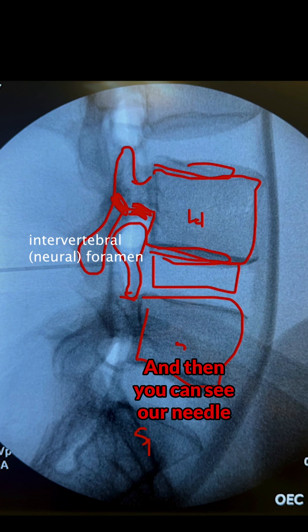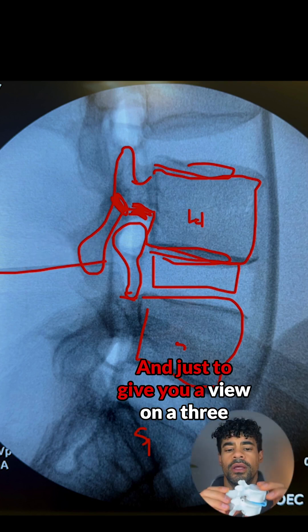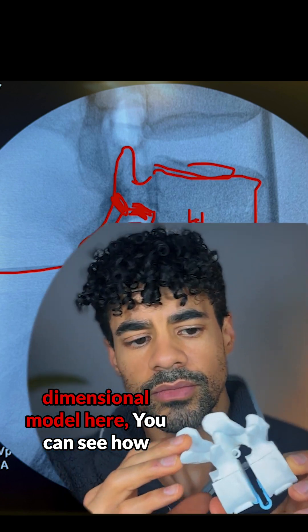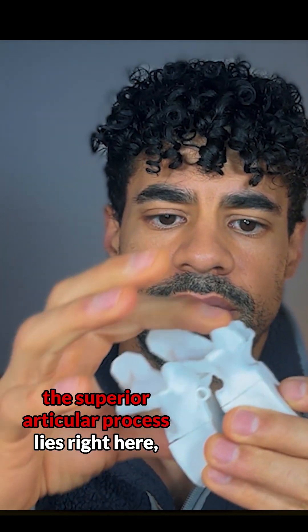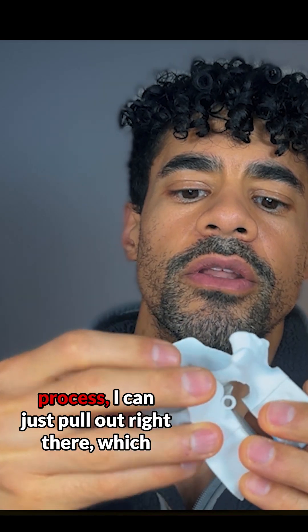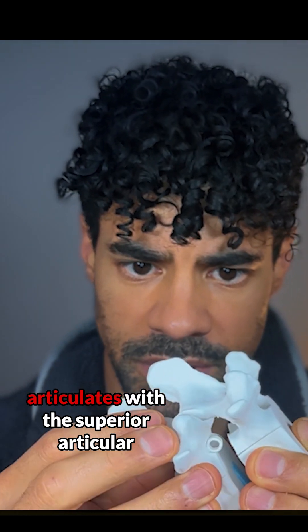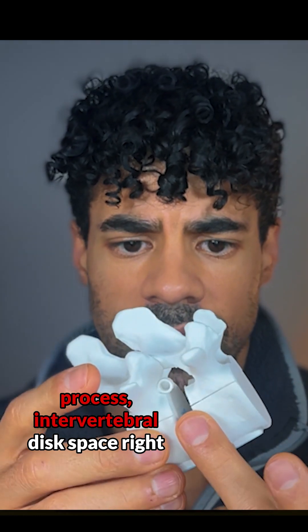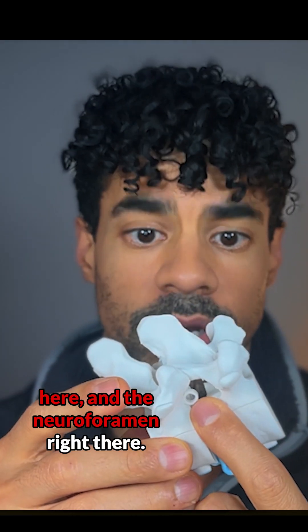You can see our needle approaching here. On the three-dimensional model, you can see the superior articular process coming all the way down to the inferior articular process, which articulates with the superior articular process below. You can also see the intervertebral disc space and the neuroforamen.